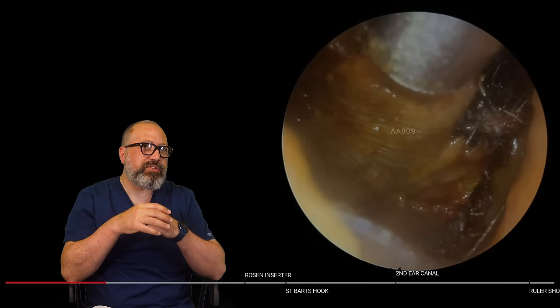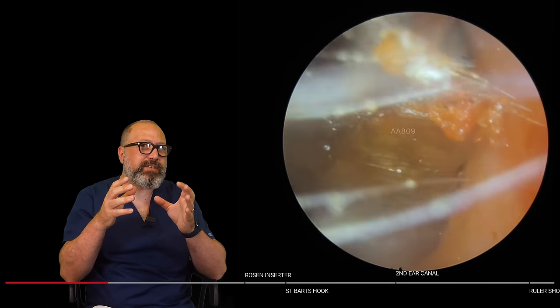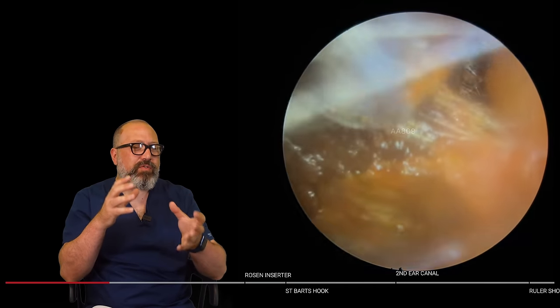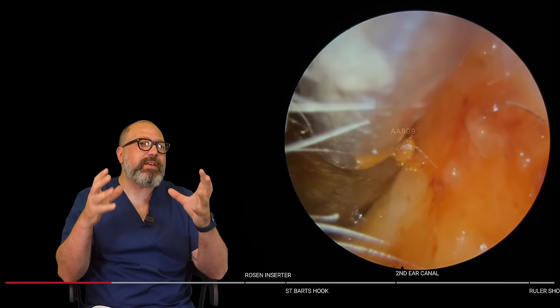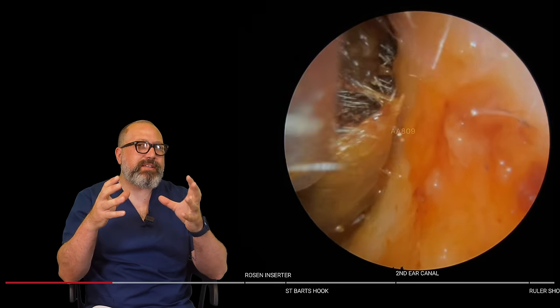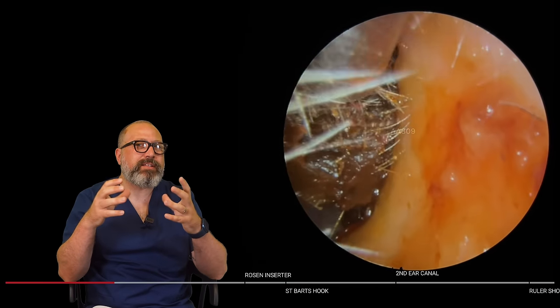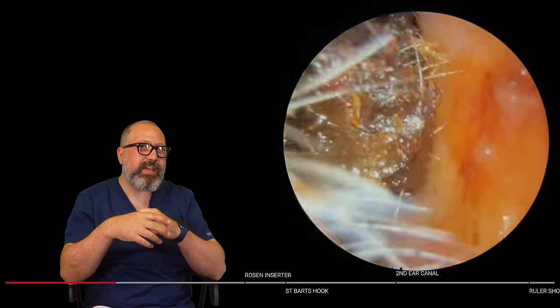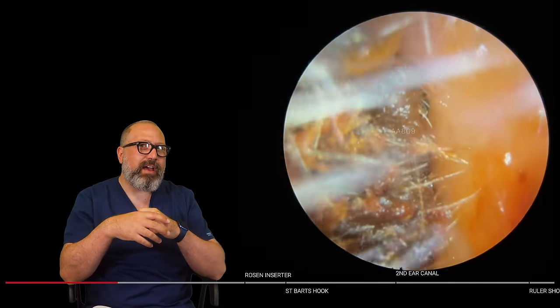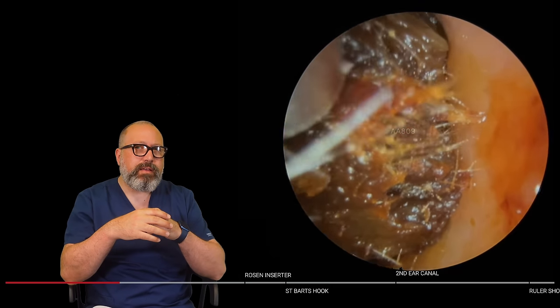So this is a long section of dry skin you can see there. It's also attached to a chunk of wax. Whereas so far we've had lots of little strips that have come away, now we've got this more solid piece, this more solid block. This tends to be the older stuff that's been pushed in all the time and compacted together. I'm trying to wiggle this out of the ear canal entrance, but it's just not really budging. It's a little bit stuck.